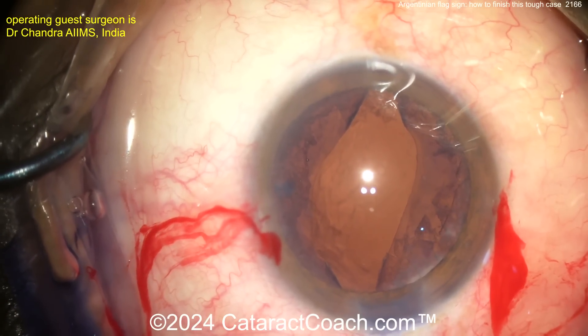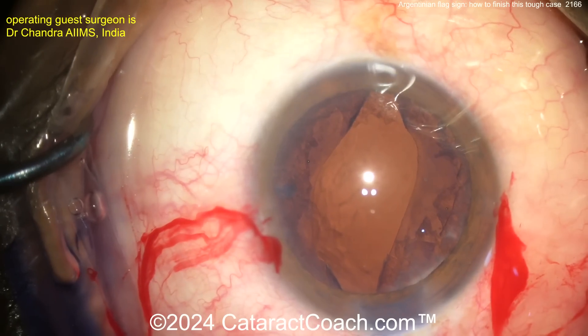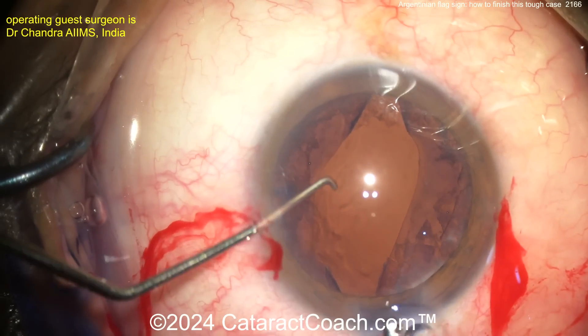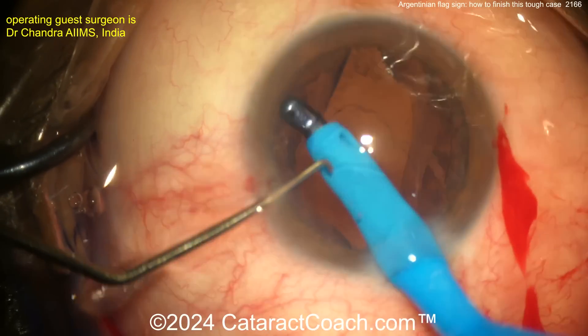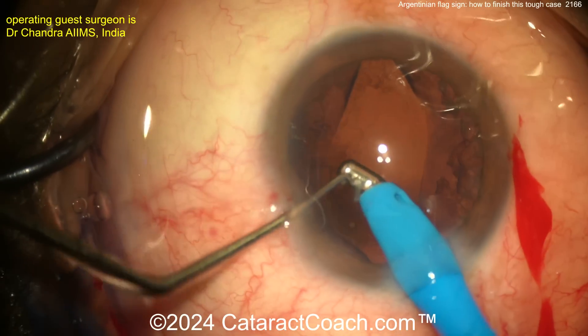You can still get it in there, but you want to get the lens in the bag without so much manipulation. Once you get the lens in the bag, don't try to turn it one way or the other. Going in with the probe — maybe just a little cleaning up here.